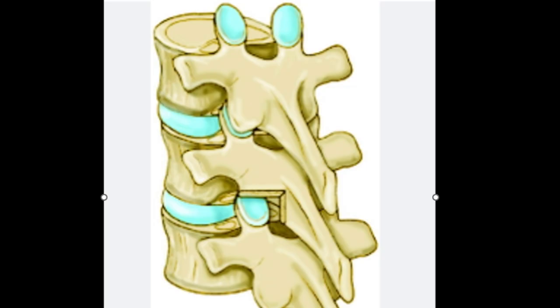The superior articular facet is a very important landmark which you have to find while operating. In this figure, you can see that the superior articular facet, when you are dissecting, is actually hidden behind the inferior articular facet, and it is not clearly visible, and often we have to do a small osteotomy of the inferior articular facet to expose the superior articular facet. We will come to why the superior articular facet is an important landmark.